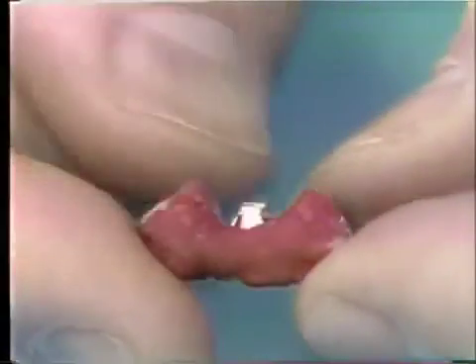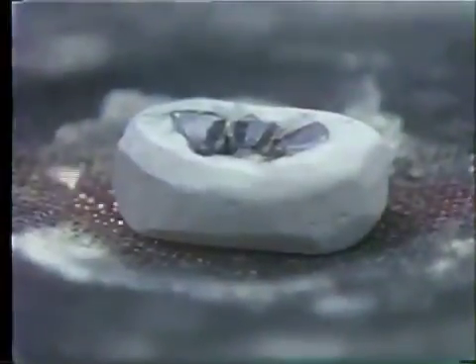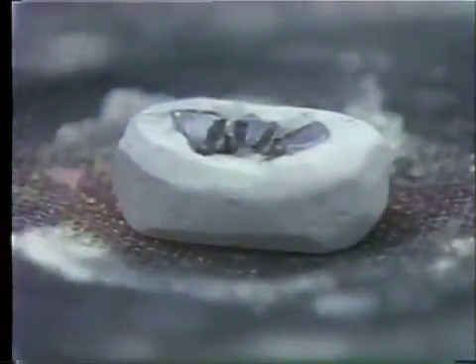This assembly will then be invested in soldering investment. The Duralay will be burned off and then soldered. We've invested the bridge and burned off the Duralay in the usual manner.